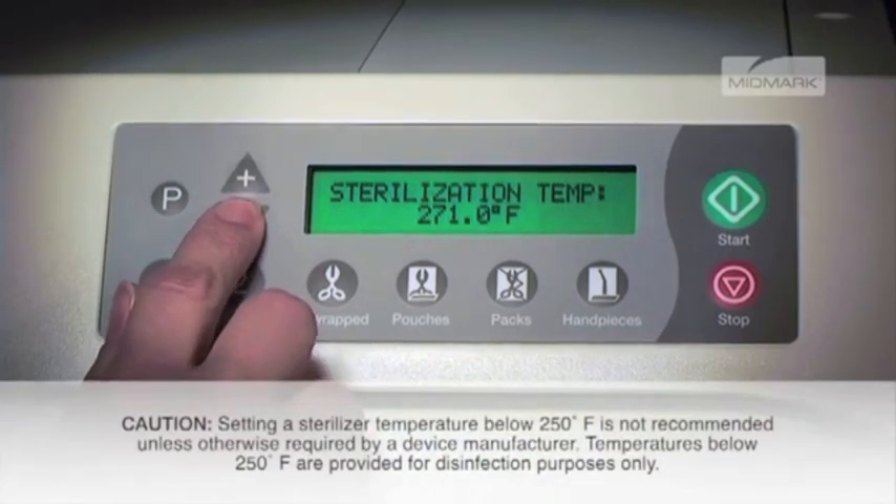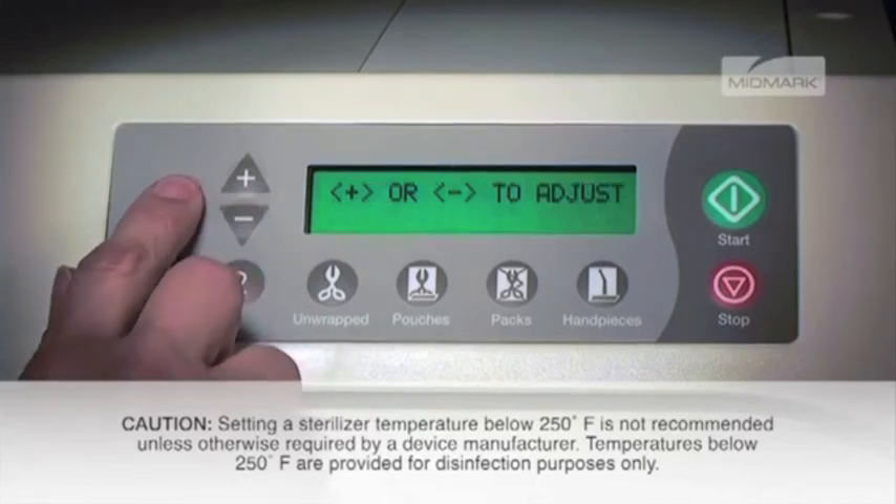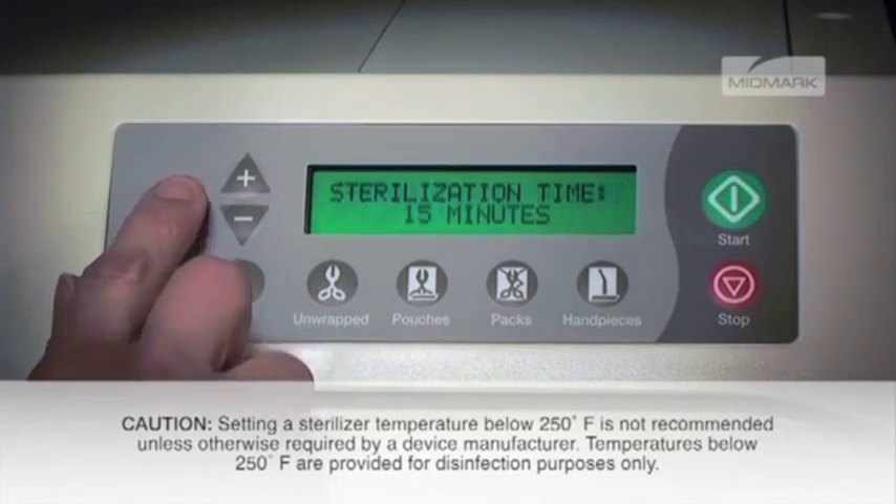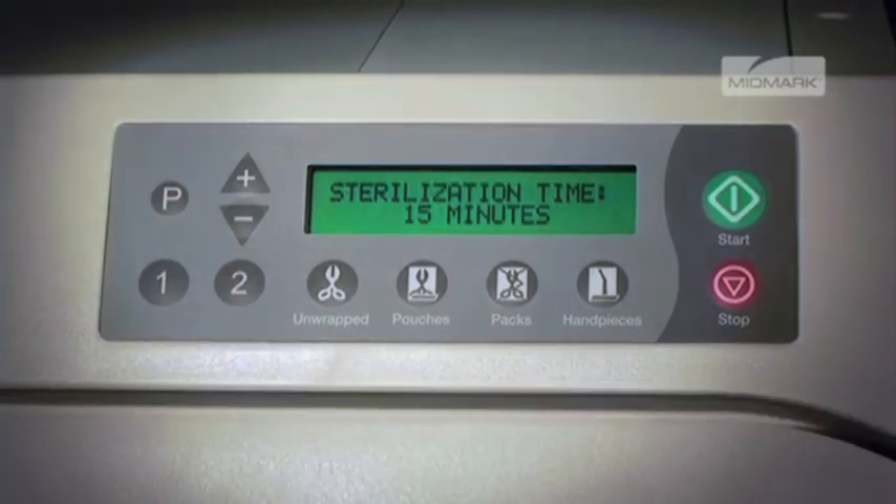Any temperature from 230 degrees Fahrenheit up to 275 degrees Fahrenheit can be selected. Once the P button is selected, the display will show sterilization time and the current value.